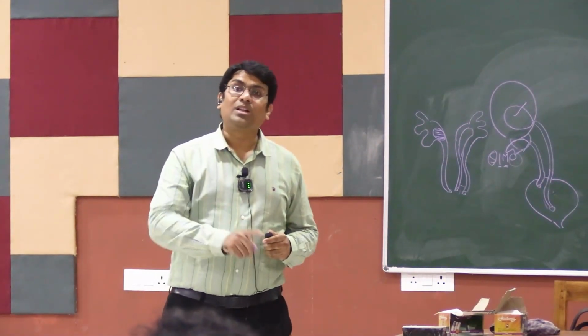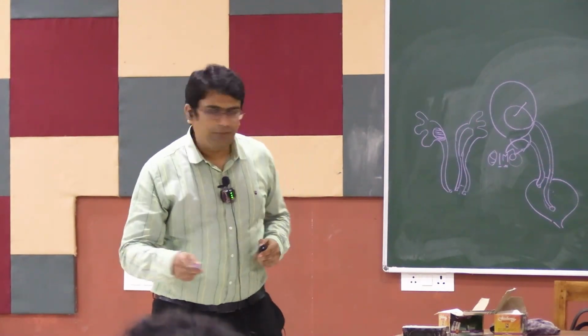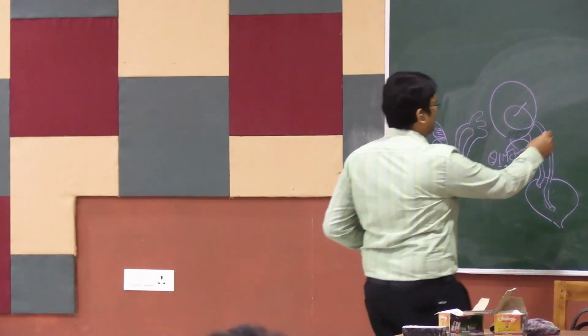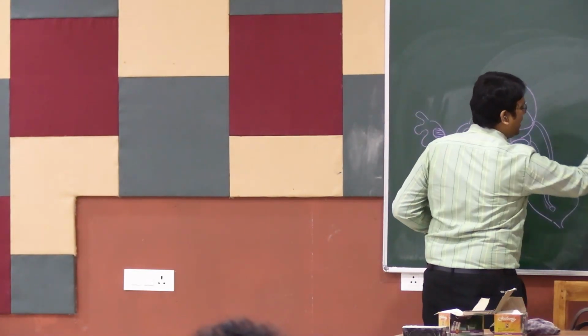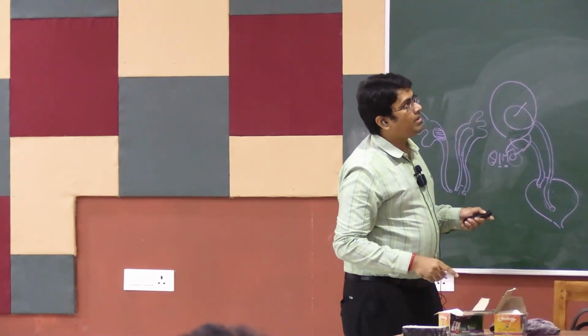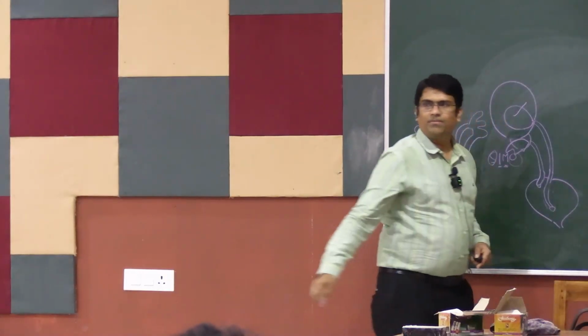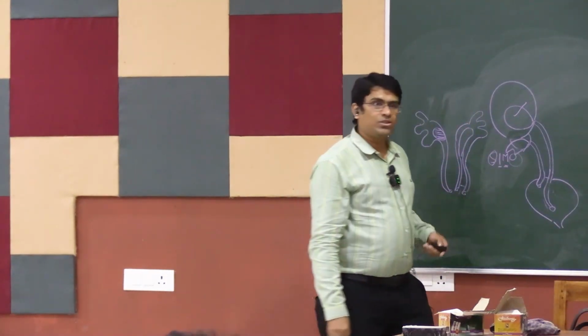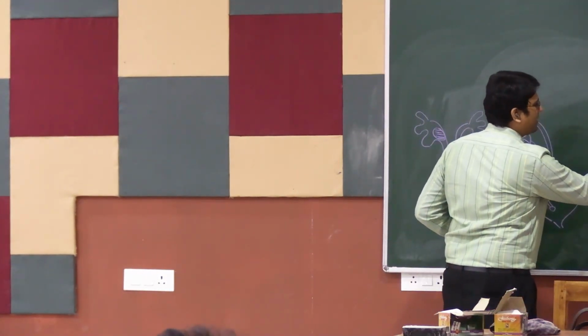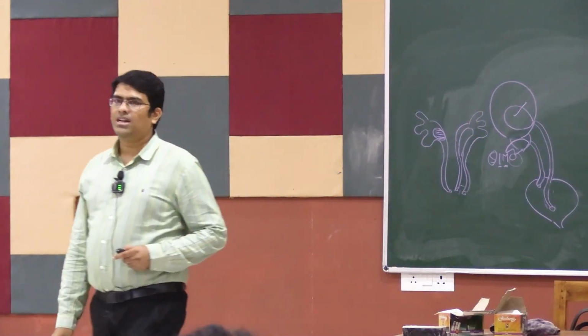So you will ask for a lateral view film. In a lateral view film, what will happen? Suppose this is the vertebra. If this was a gallbladder stone, it will remain in this position. If it is a renal stone, it will come almost here. So this is the favorite question asked by the examiners.